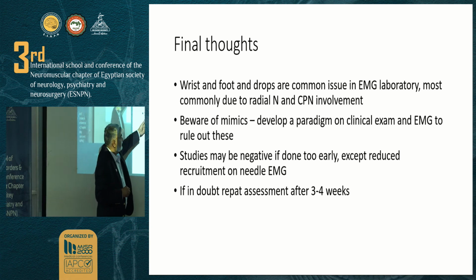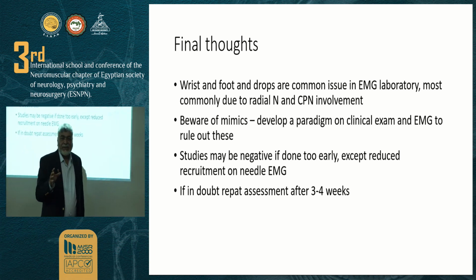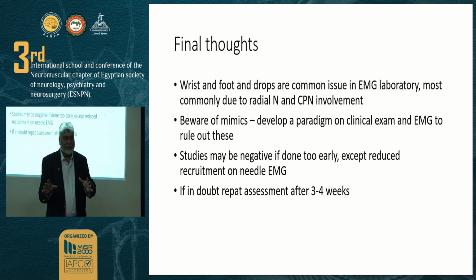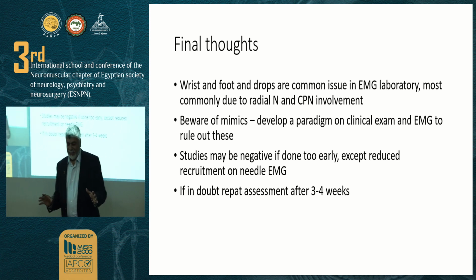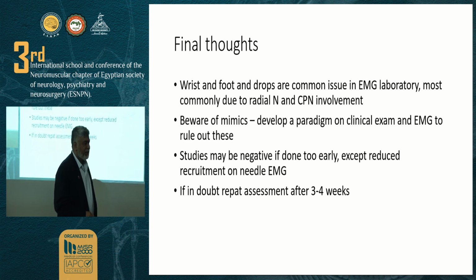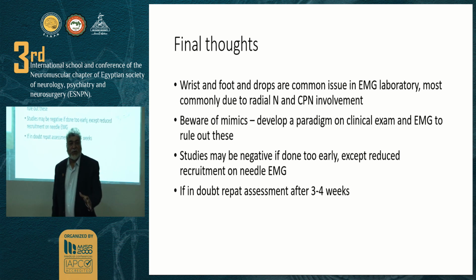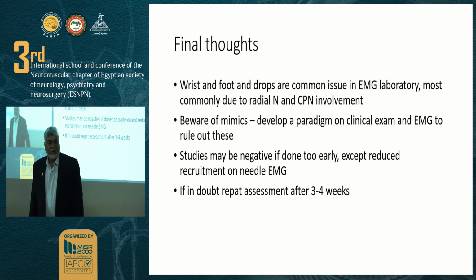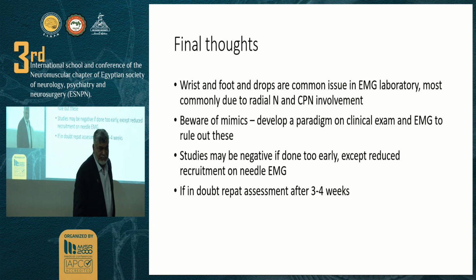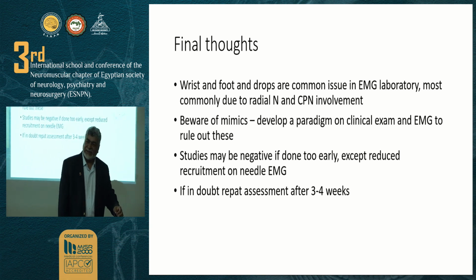This is another thing. If somebody comes to you with foot drop, okay, this is the Adam. You'll make my day if you tell me the answer to this question, okay? Everybody awake? A patient comes to you, had a foot drop 3 days back. I've got the answer over here. I already know. If somebody who's got a foot drop 3 days comes to you, what is the key finding on the exam? The recruitment, okay? That's why I keep talking about recruitment. You won't get fibrillations, you won't get fasciculations, and the CMAP will be completely normal.